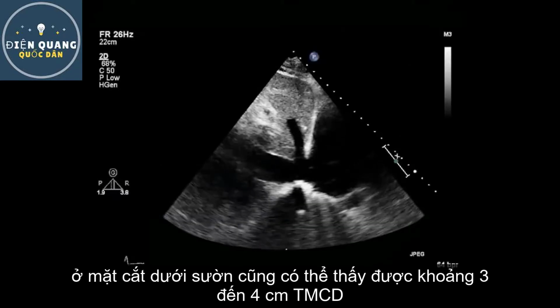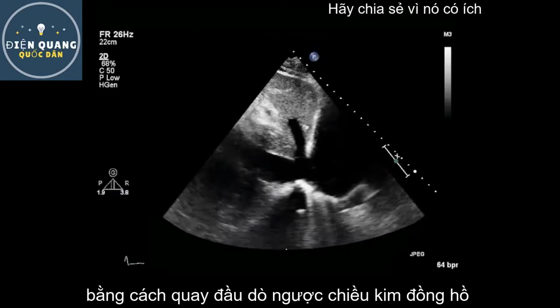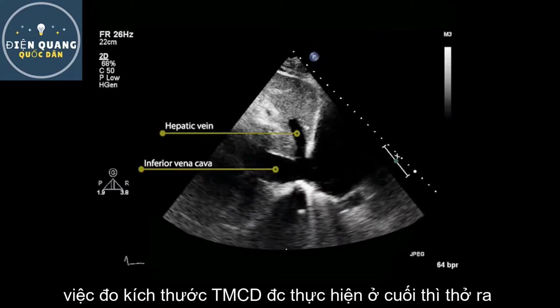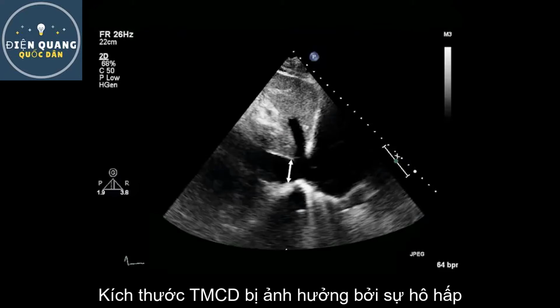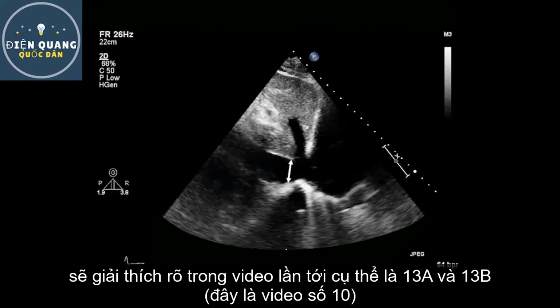From the subcostal view, we can also visualize the proximal 3 to 4 centimeters of the inferior vena cava by rotating the probe anti-clockwise. The measurement of the inferior vena cava diameter should be made at end expiration and just proximal to the junction of the hepatic veins that lie approximately 0.5 to 3 centimeters proximal to the ostium of the right atrium. The change in diameter of the inferior vena cava at rest and during inspiration, known as respiratory collapse, can be used to give an estimate of the right atrial pressure. It is explained in more detail in video clips 13a and 13b.